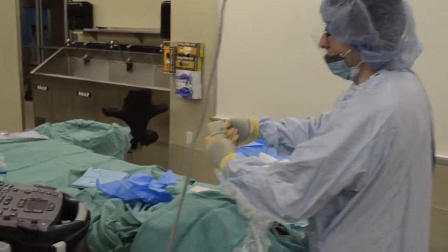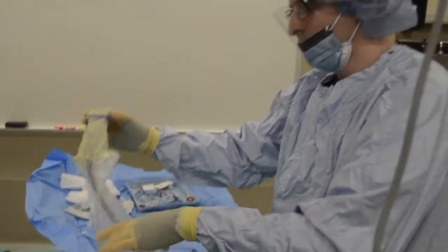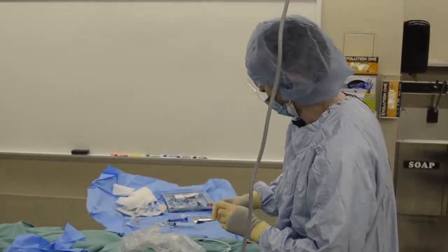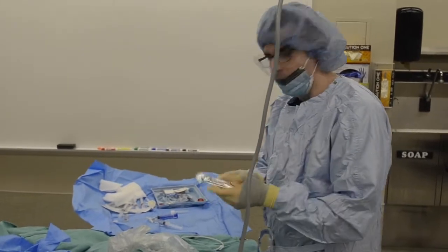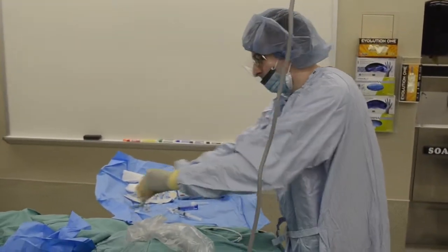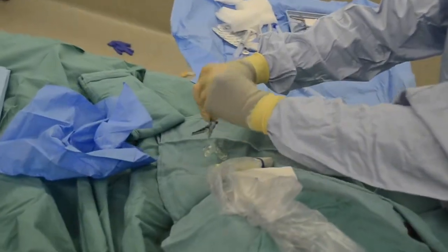Then you'll attach your rubber bands. And how many rubber bands come in the packet? There are 2. Try not to drop them. This is our sterile gel. I usually like to make a little puddle right next to myself, so I don't have to re-squeeze.